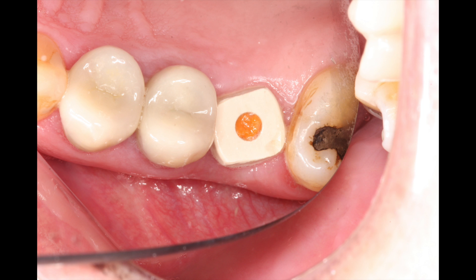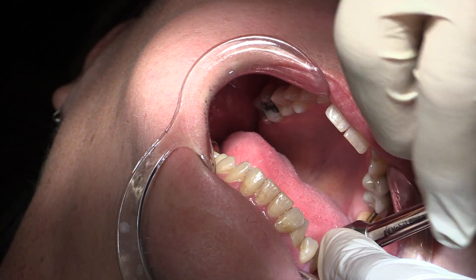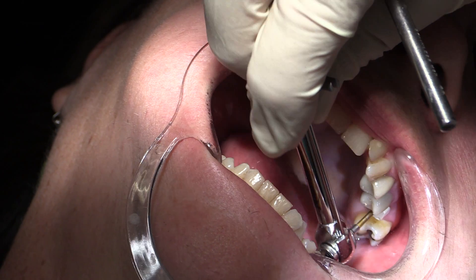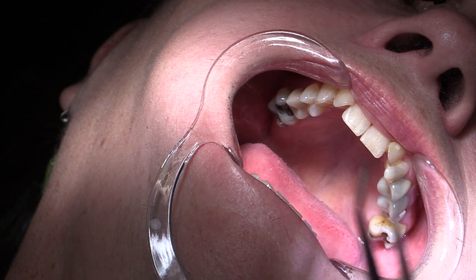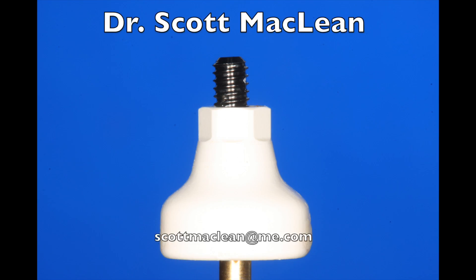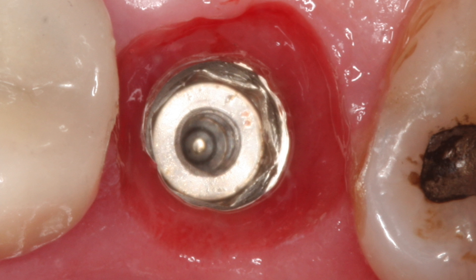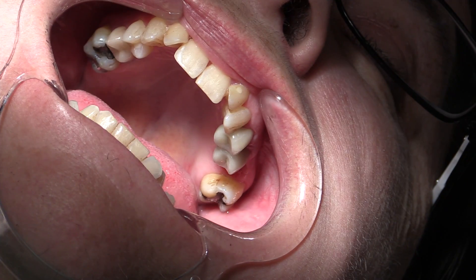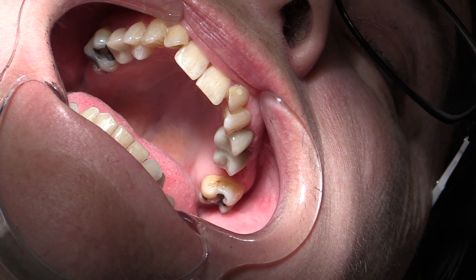So we're going to take this PEEK abutment off so we can have a little look inside. If you put a little pressure down on the torque wrench you can just keep unscrewing it, which is a fast way to get it off. Once it's unscrewed, you have to actually pull it off because the screw goes through the abutment into the implant. Looking down inside, the tissue is sealing off this implant quite nicely — the platform shift is covered over by soft tissue. The patient is not really feeling any of this; she said she didn't feel any of the insertion.